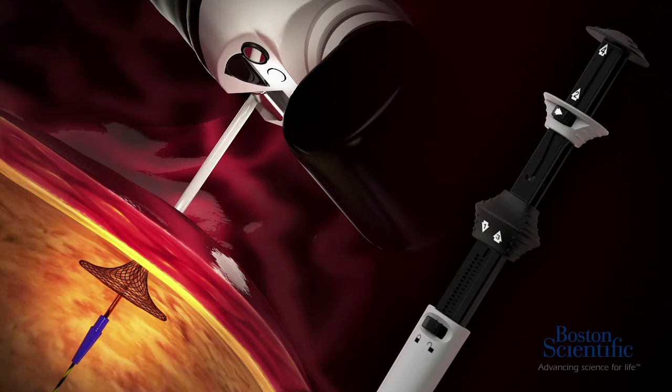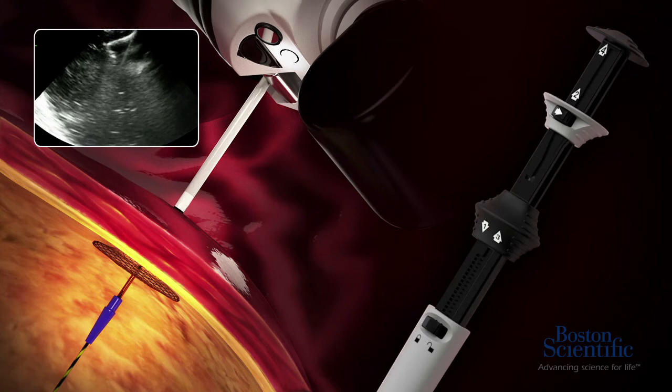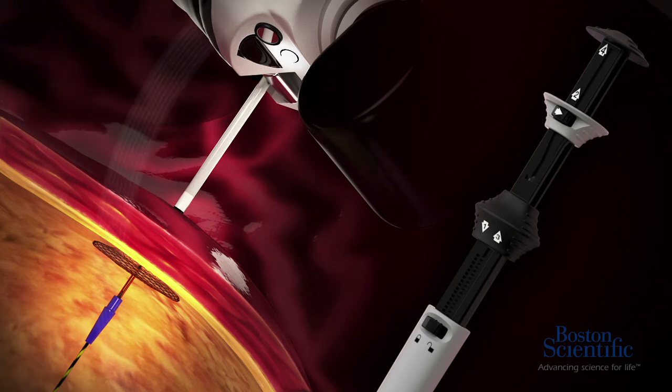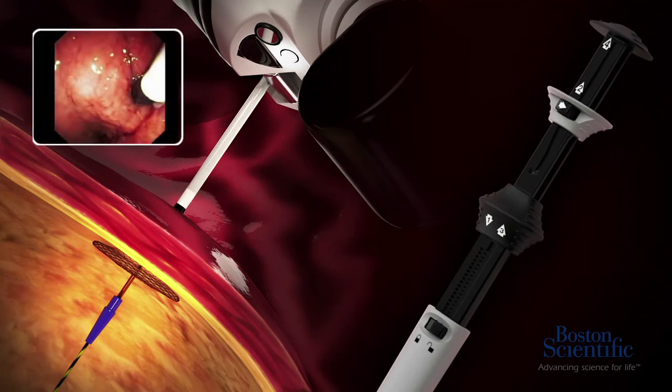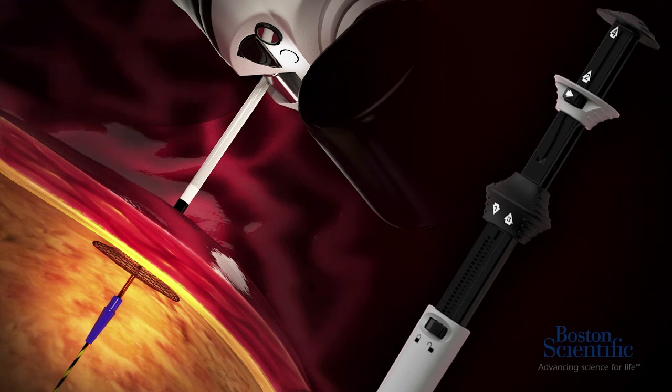Step number three. Pull the endoscope back slightly in order to directly visualize the catheter shaft in the GI tract. Unlock the catheter lock and slide the catheter control hub upwards until at least two to three millimeters of the black catheter shaft marker is visible in the GI tract. This indicates that the Axio stent is correctly positioned for the final stage of deployment. Then lock the catheter lock.